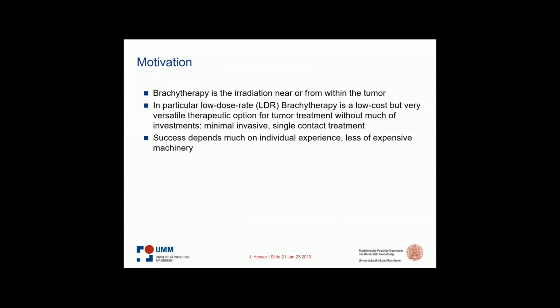The motivation is that brachytherapy is one way of irradiating tumors, either having the source near or within the tumor. In particular, low-dose-rate or LDR brachytherapy is a low-cost but very useful therapeutic option for tumor treatment, which doesn't need a lot of investment.